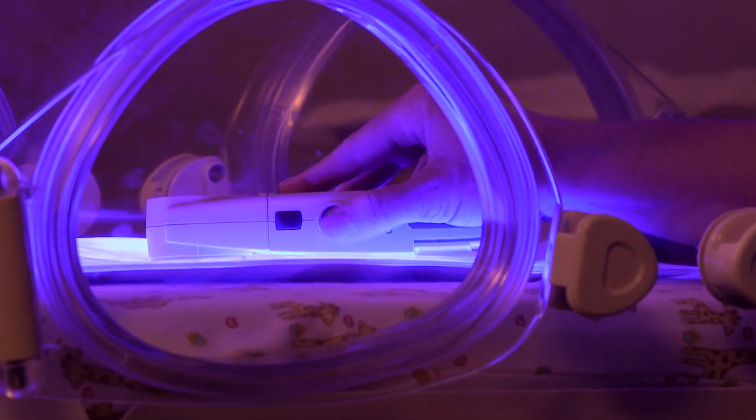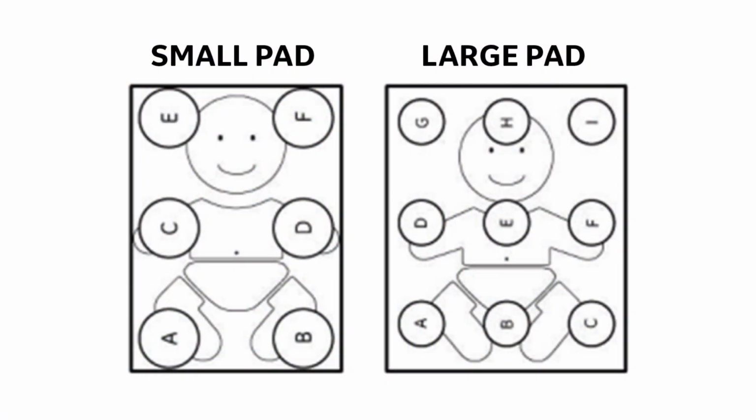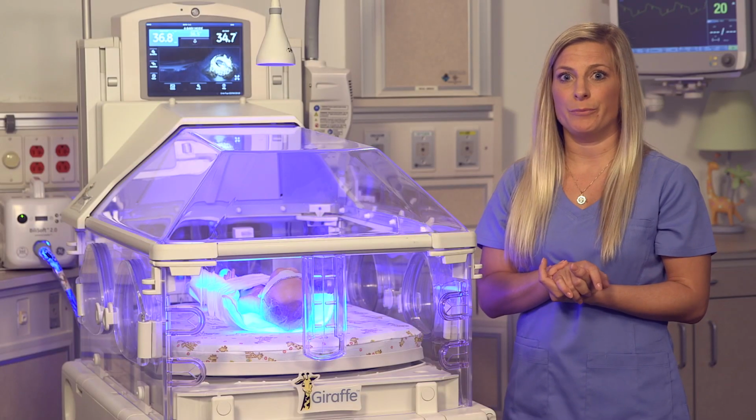I'm using the approved Omeda Medical BiliBlanket Meter 2. Take measurements on the lit side of the pad using the meter placed at points as shown on the back of the pad. So, take out your BiliBlanket 2 meter.